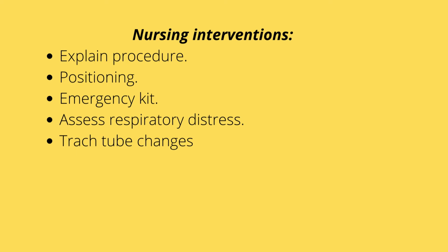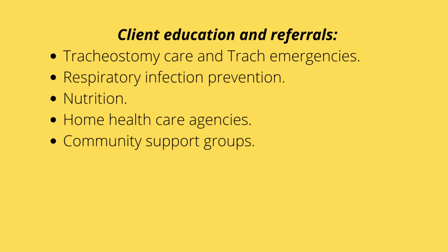What do we do? We always explain the procedure to the patient, get them relaxed. We position the patient in a semi or high Fowler's position. We always keep an emergency bag by the client's bed with them at all times, right? If it's home care, the patient is going maybe to the mall, carry that emergency kit with you everywhere you go. Even if it's to the bathroom, it's with you. Why? In case of decannulation, you have everything you need.